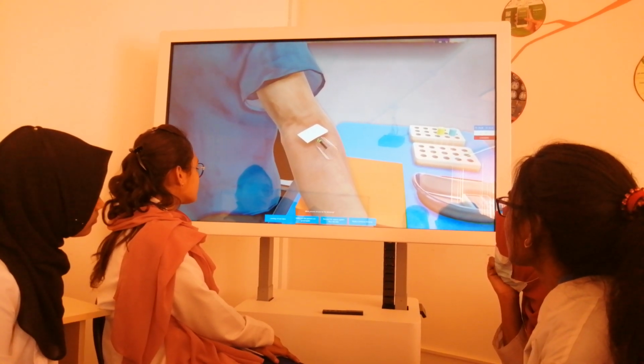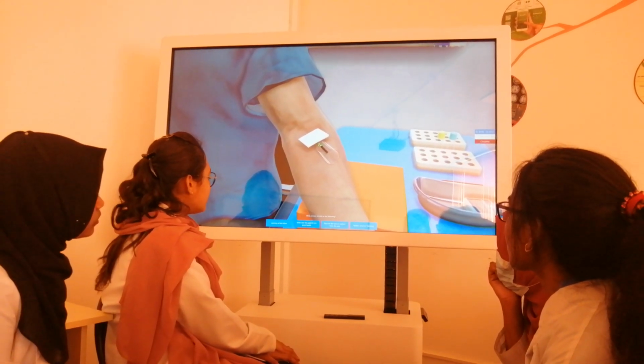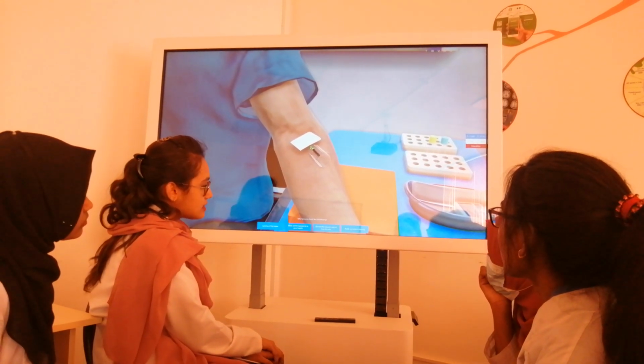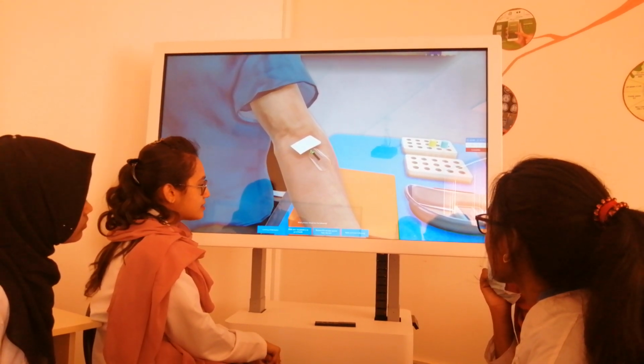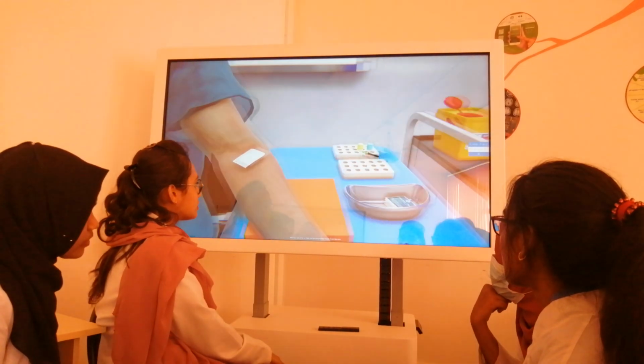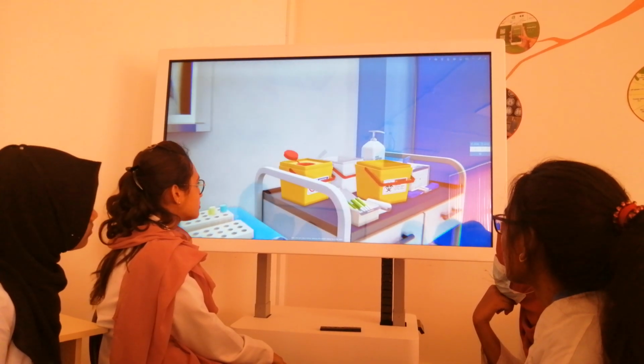What process should be the following? Apply pressure dressing. Labeling of test tubes. Make sure the patient is in good health. Remove the vacuum system from the vein. After the last tube is filled, remove the needle holder from the vein.